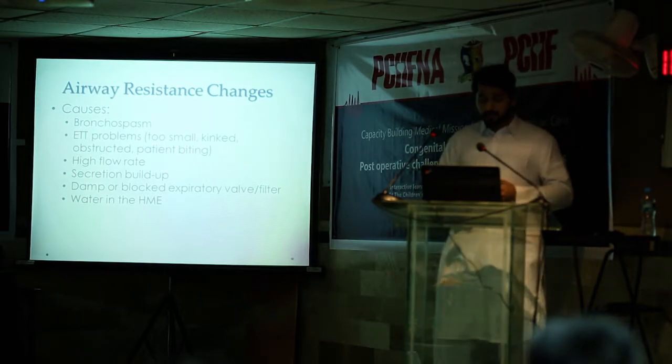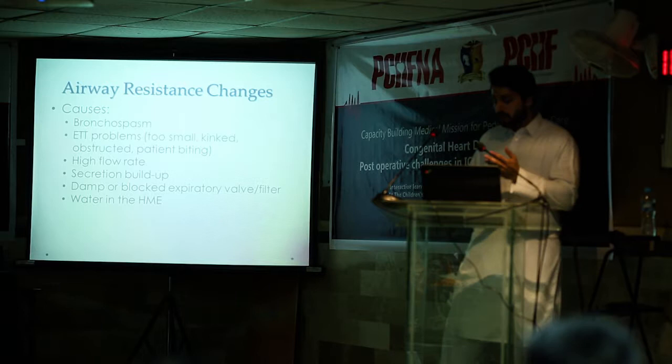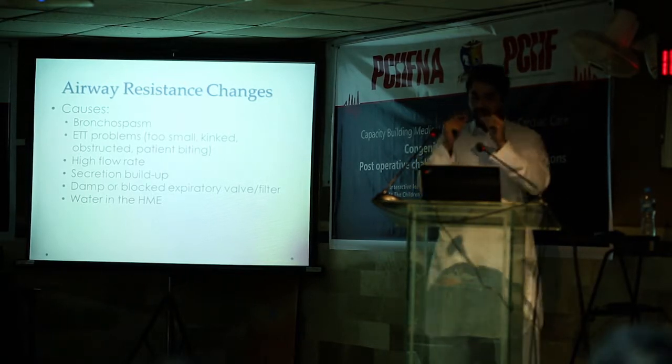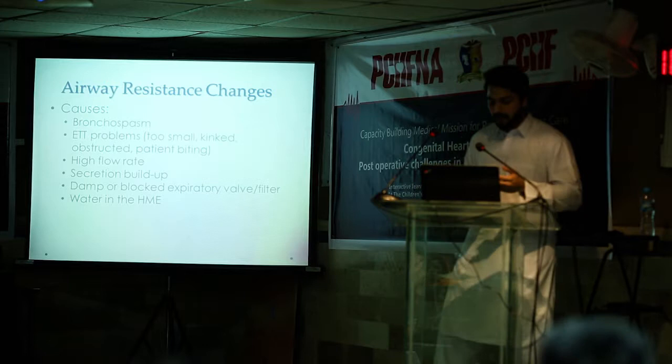Another thing, as Sadiq explained, is airway resistance. How do we diagnose or identify that there is airway resistance? Before that, we have to know the causes: bronchospasm, ET tube problems. Sometimes the ET tube is very small or kinked. All of this will cause changes in the airway resistance.